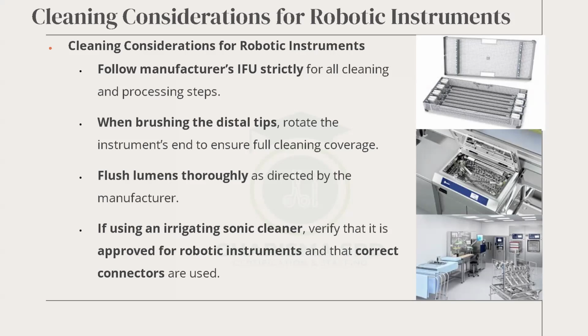So in this case, you manually clean it, flush all the ports, clean the tips, and then pass it through the washer. That's why you have the third picture, which is at the bottom. All right. Is everybody okay? Yes. All right. Awesome. Next slide.